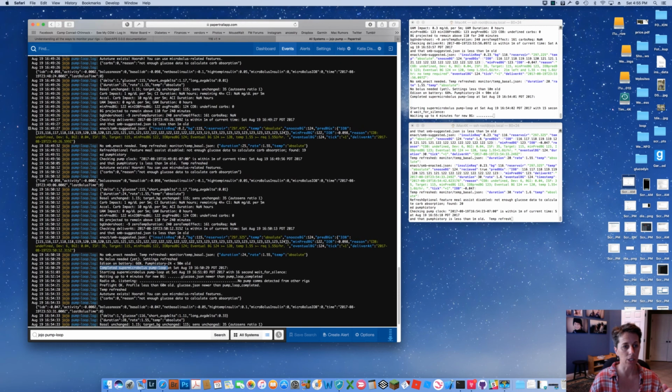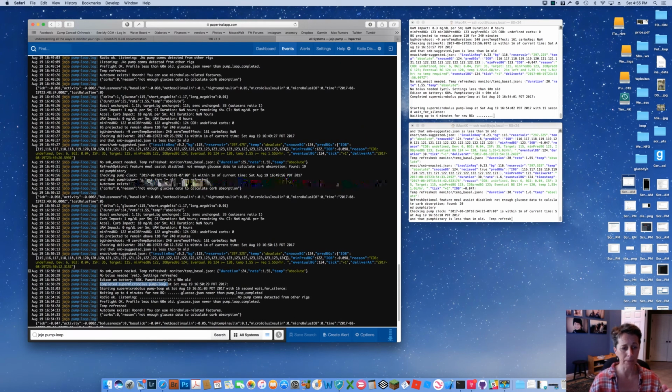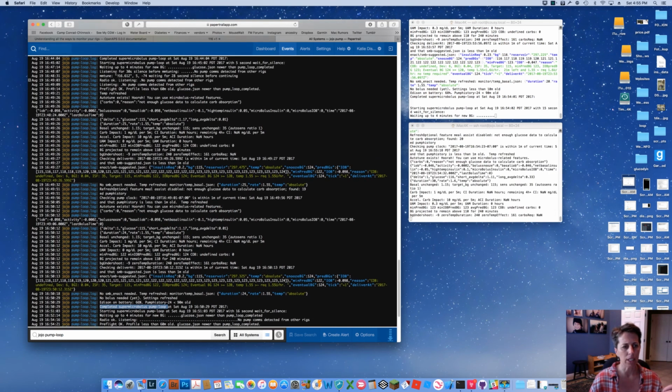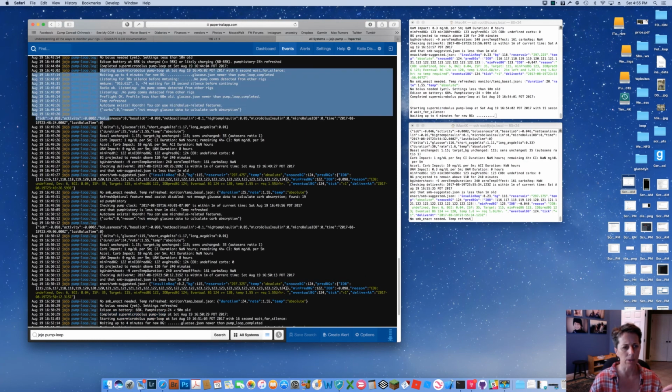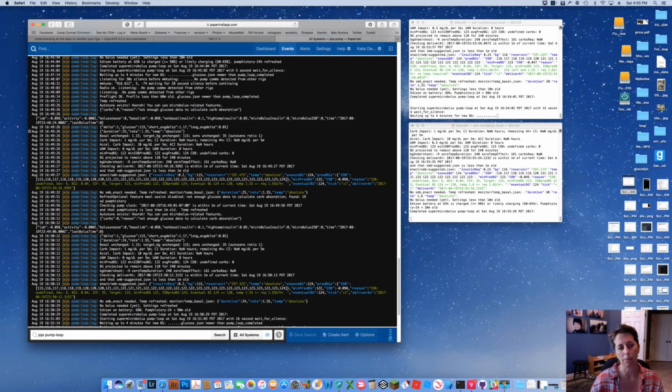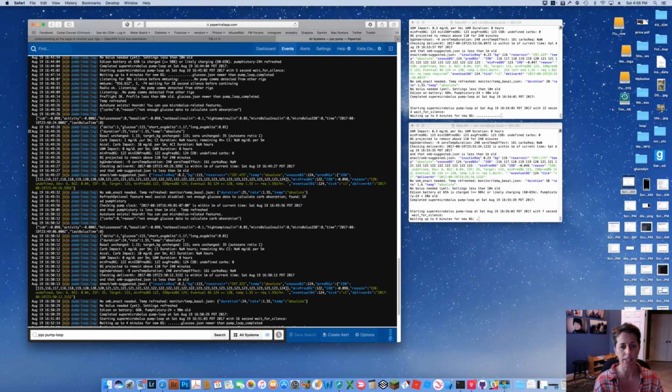So it takes a while to do a whole pump loop. There's a lot of messages that go into it. So there, that is one whole pump loop. We can see that pump loop took 3 minutes to complete. So just giving you an idea, all of this is one pump loop. It has to go to your pump and get data and history. It has to compare that with the times. It has to look at carb impacts. It gets fresh blood glucose data. And it verifies whether or not the temp basal was received and sent and all of that kind of stuff. So it takes a while to run through.